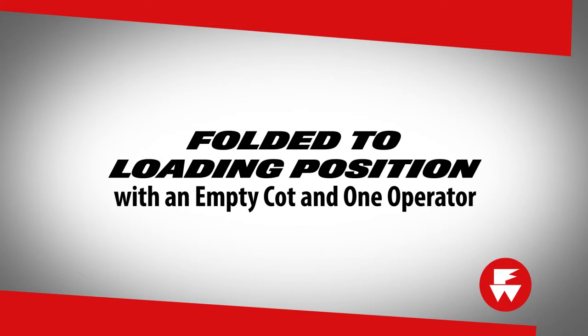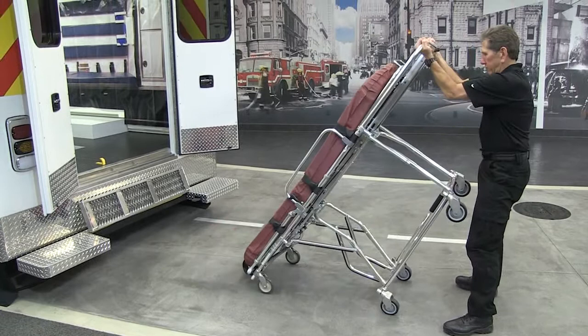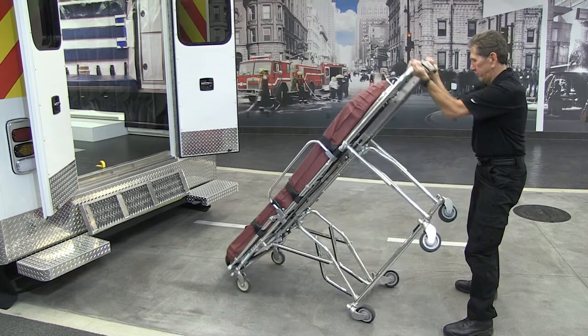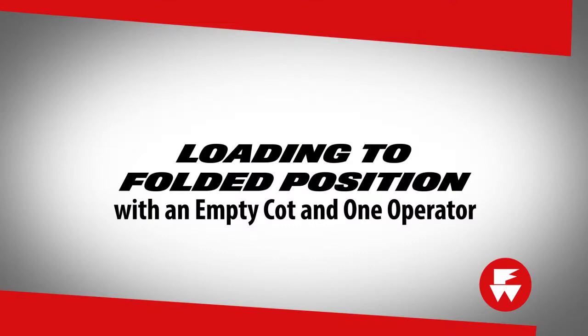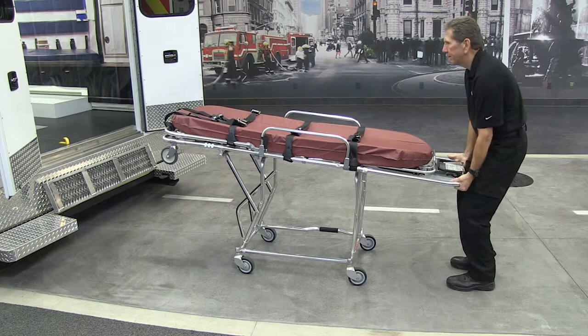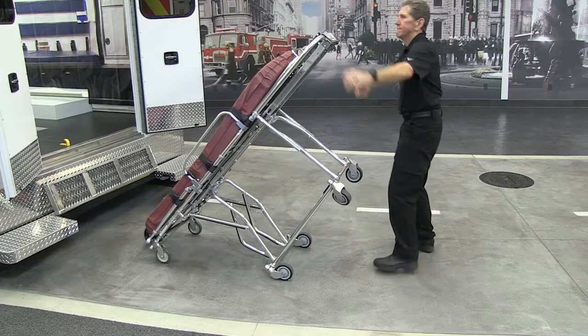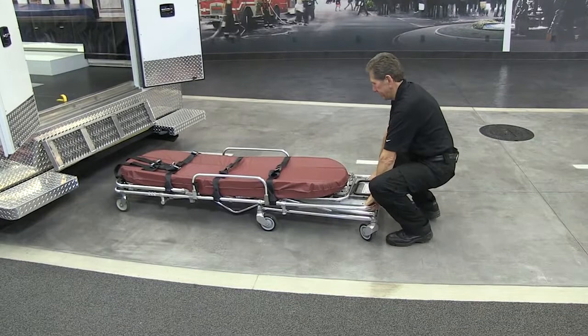To adjust the cot from the folded to the loading position with one operator and an empty cot, grasp the mainframe at the foot end. Lift until the undercarriage unfolds and locks in the loaded position, then pull the cot down onto its transport wheels. To adjust the cot from the loading position to the folded position with one operator and an empty cot, grasp the mainframe and lift the cot forward until the loading wheels touch the ground. Unlock the auxiliary lock. Support the foot end of the cot by squeezing the foot end control handle and lowering the cot into the folded position.